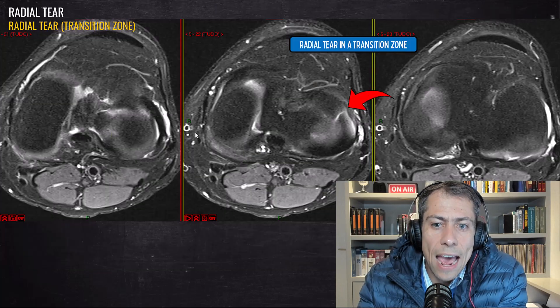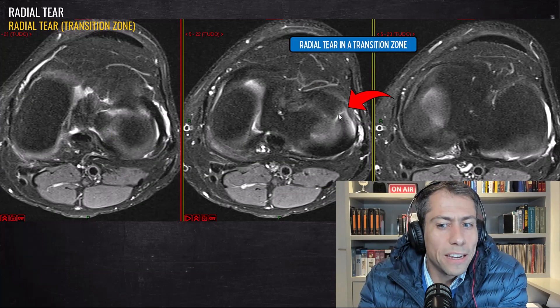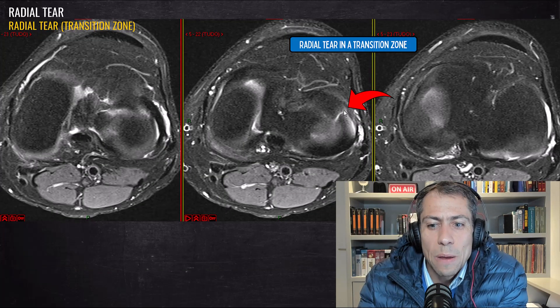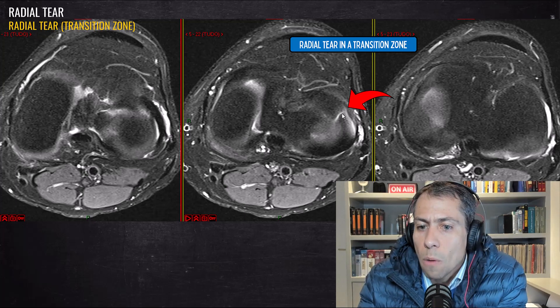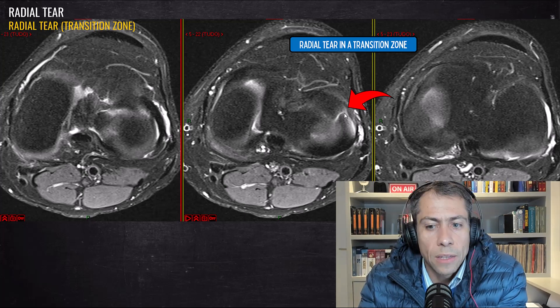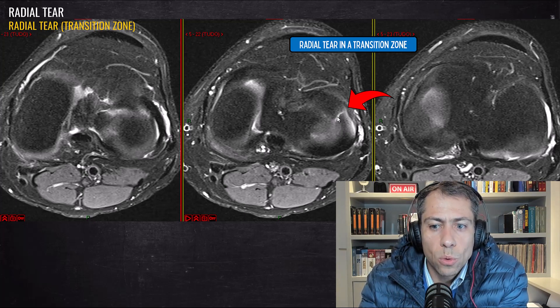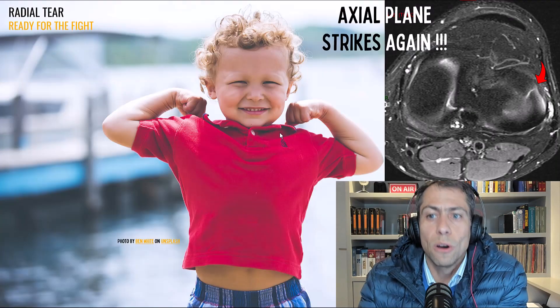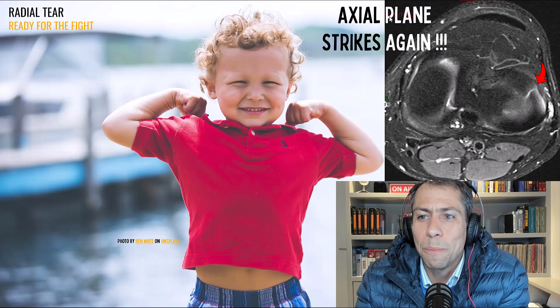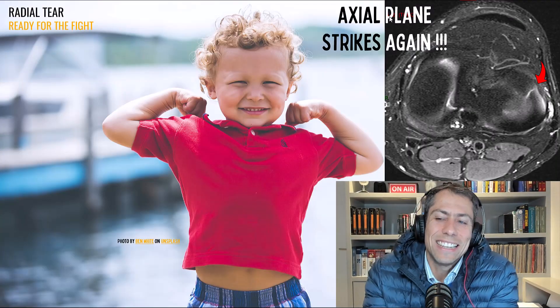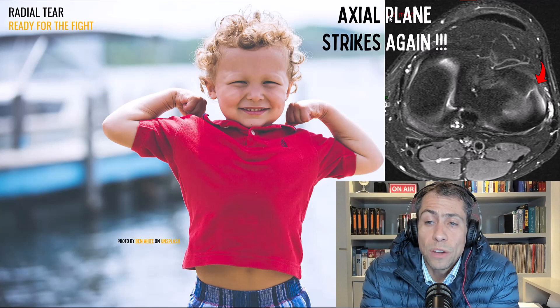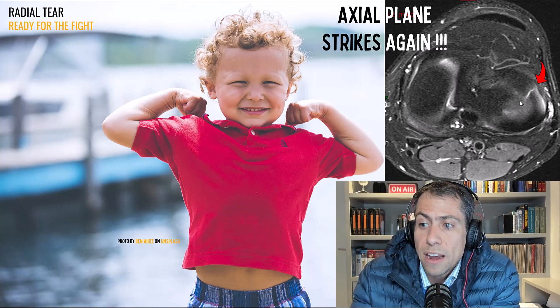Here the image is enlarged so you can appreciate the marching cleft sign. Look at the axial plane — you can see beautifully this tear in this region. It's almost a complete tear in this case. The axial plane was the best plane to identify this tear. The axial plane was very important to define the radial tear in this area.